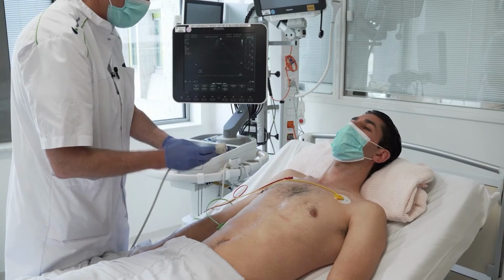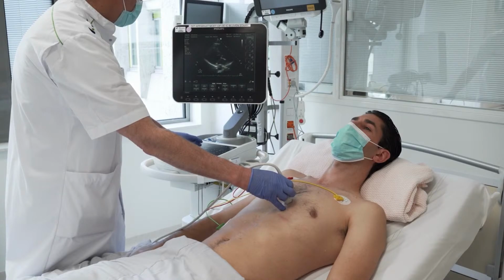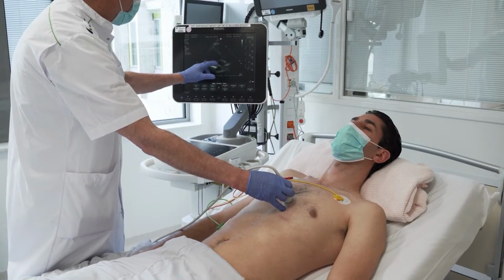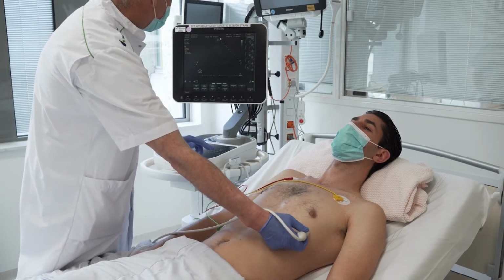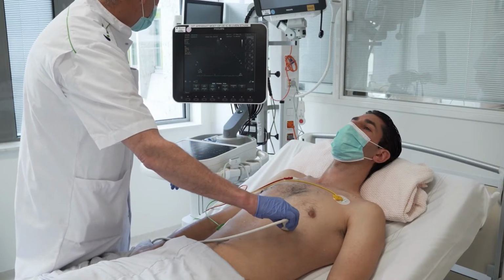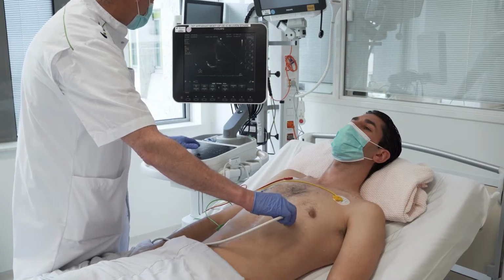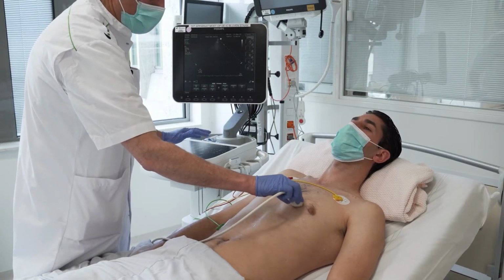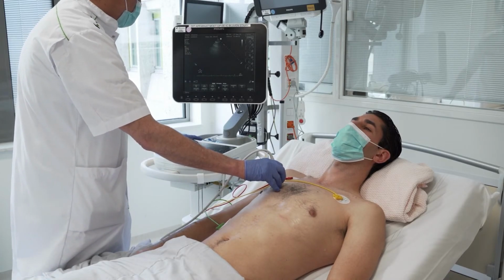From there you go to the parasternal. And of course you don't have to do all the movements, you don't have to do all the views, depending on the clinic or the situation. Here again we have the parasternal long axis. You can do the short axis, etc. If you want, you can do the apical, and Sakir was very successful in that one. So we have a very nice 4-chamber view. So that took me maybe 30 seconds.